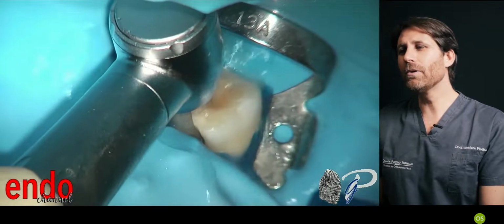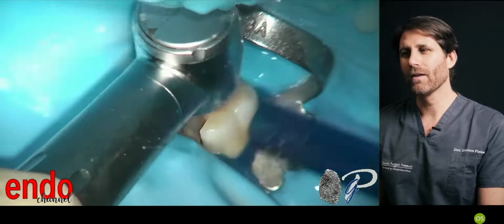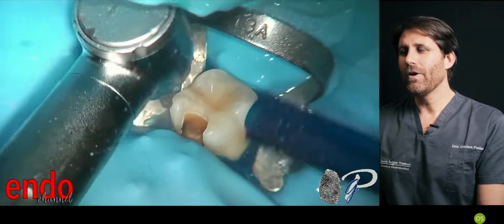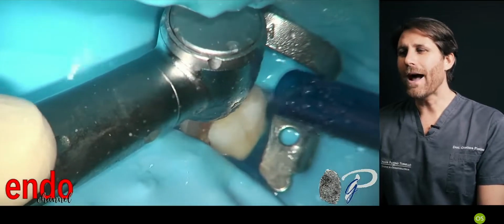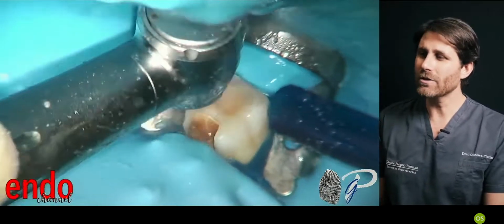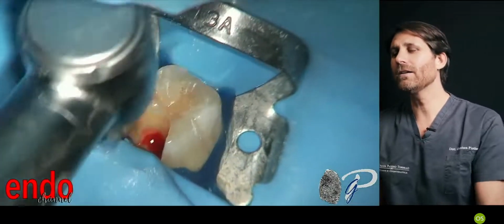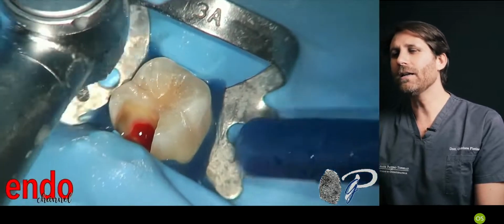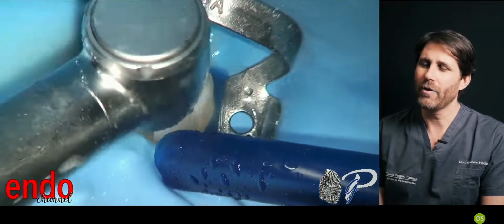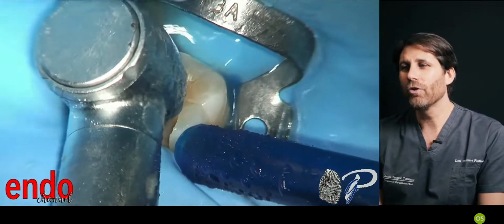And then with a simple burr, just start removing the carious tissue from the mesial aspect. Remove all the caries and the undermined enamel, in a dynamic way. So just remove the bulk of the caries, and as soon as we have removed it, we are penetrating the pulp chamber. You can see. Clean the dentin very well from the carious tissue. Try to be as clean as possible before entering the root canals.